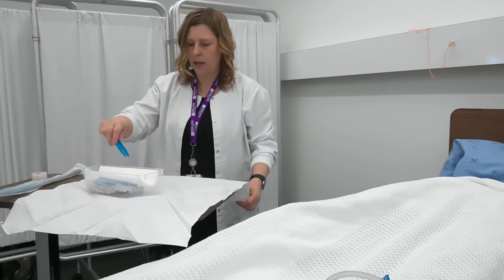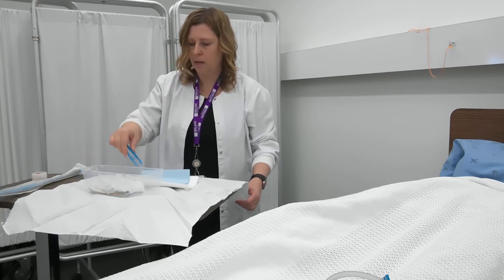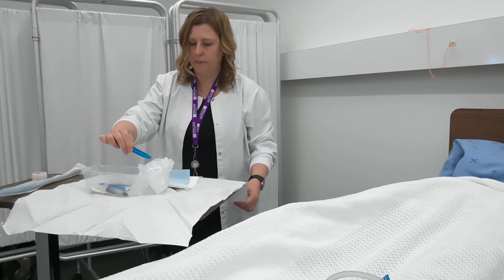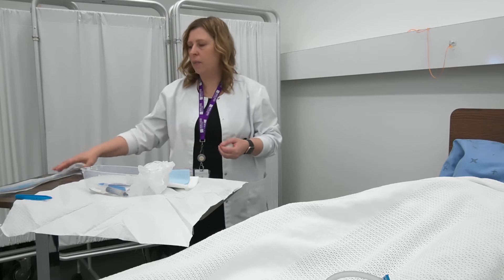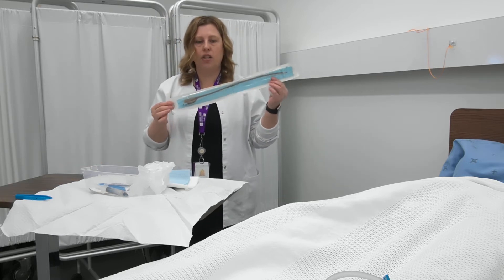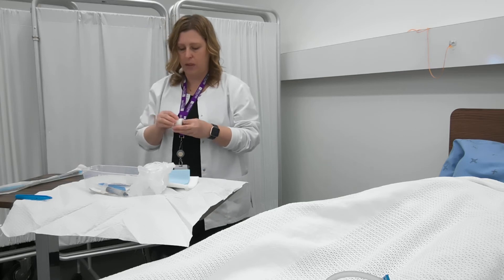Now I can go ahead and remove some items out of my tray. My gloves are right here. I'm going to place my forceps on the side, and then I'm going to take my catheter package. You'll notice there's an outer package and an inner package. The inner package is sterile, so I don't want to touch that — I just want to make it easier to remove it from the packaging and place it on my tray later.